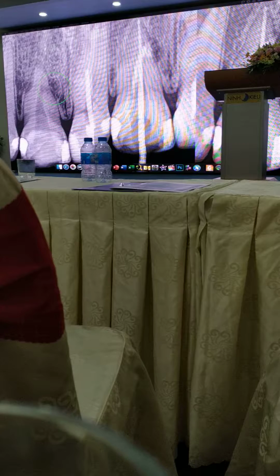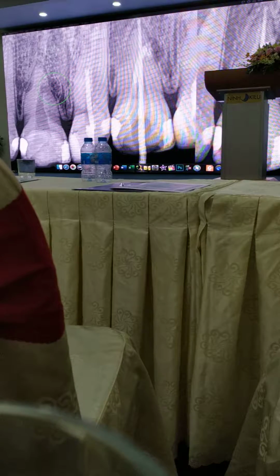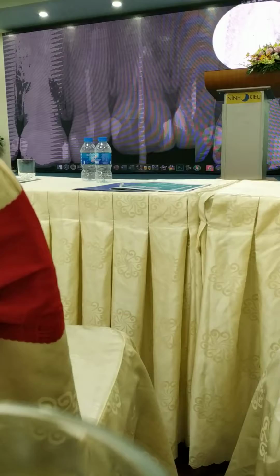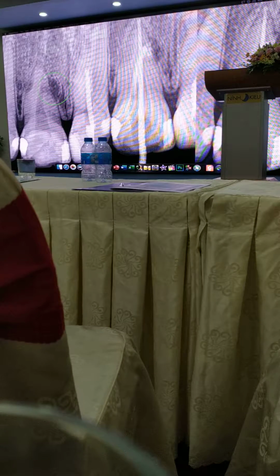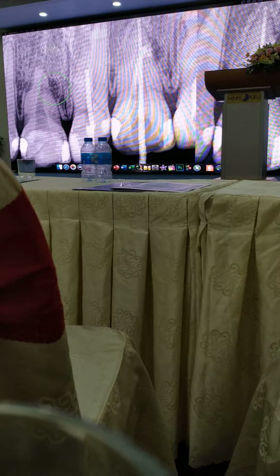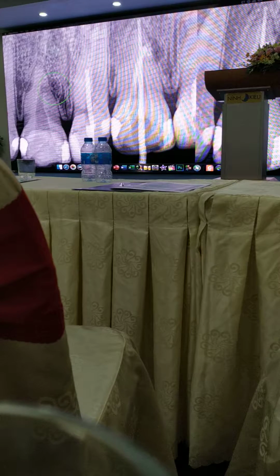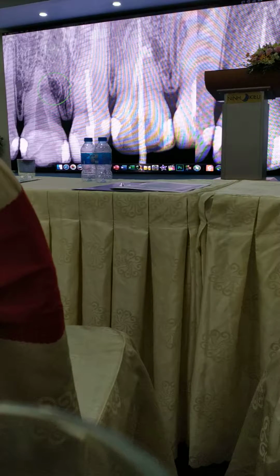I proceeded that way, and as you can see, in the second appointment I managed to follow the main canal, and this was my final obturation. I didn't have to do a surgery. I didn't have to extract the tooth and treat it outside of the socket. I was able to do just a regular root canal treatment with a small variation in the protocol because of this type of sealers.